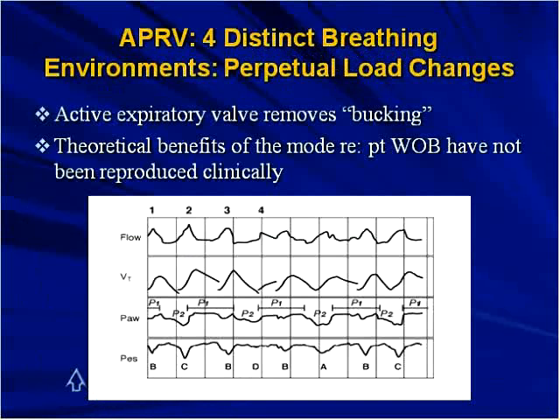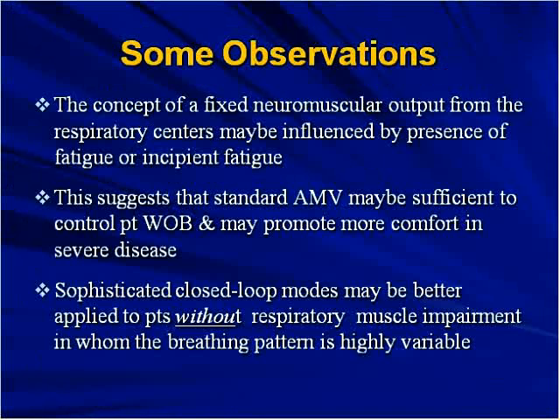And essentially, the advantages of APRV, the active expiratory valve removes bucking. That is a huge advantage. We can get that on other modes, though. But the theoretical benefits of the mode in terms of patient work of breathing have not been reproduced clinically, and in our small series of patients, it was actually much higher than traditional modes of ventilation.